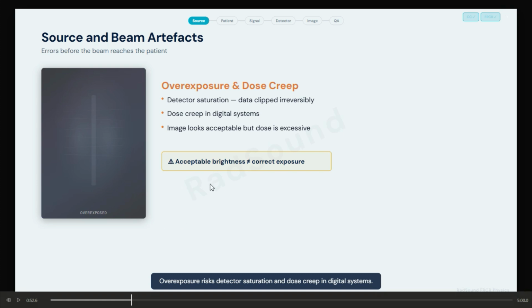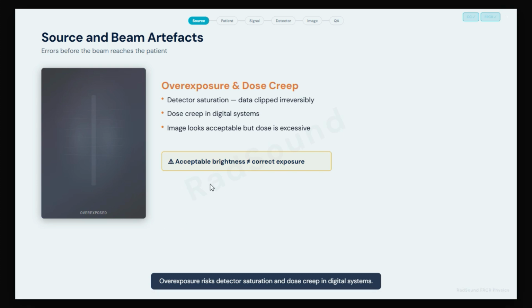Mostly you reduce the mA appropriately to the level of that exam. Check the exposure index and deviation index for every exposure. Whether it is negative, that's underexposure, or positive, overexposure, it should be around 0 for perfect, better imaging.